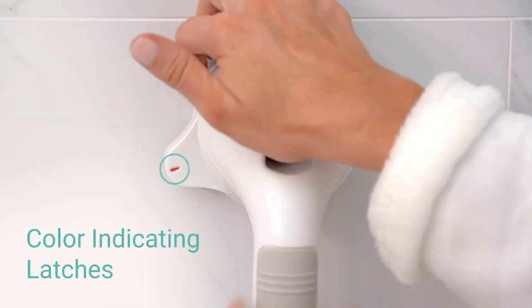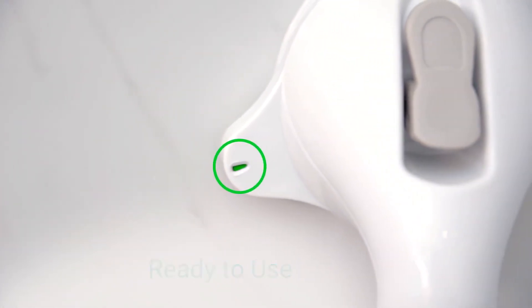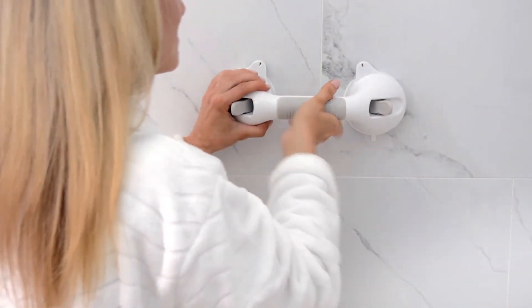Color indicating latches ensure safe and secure installation. A green display means the bar is ready to use and a red display means the seal is not airtight. Simply adjust the location or angle for the perfect fit on your bathroom or tub wall.